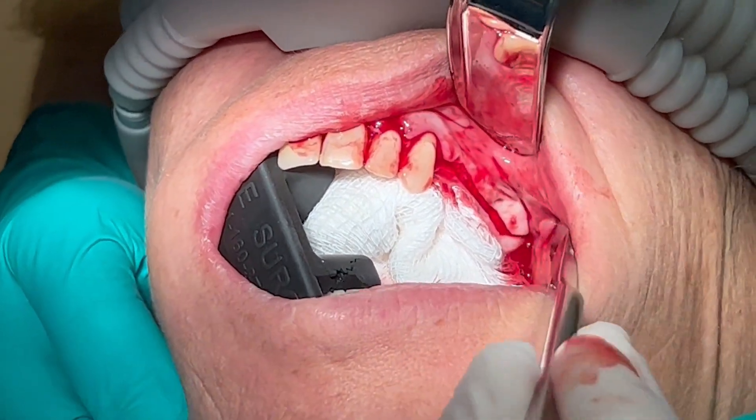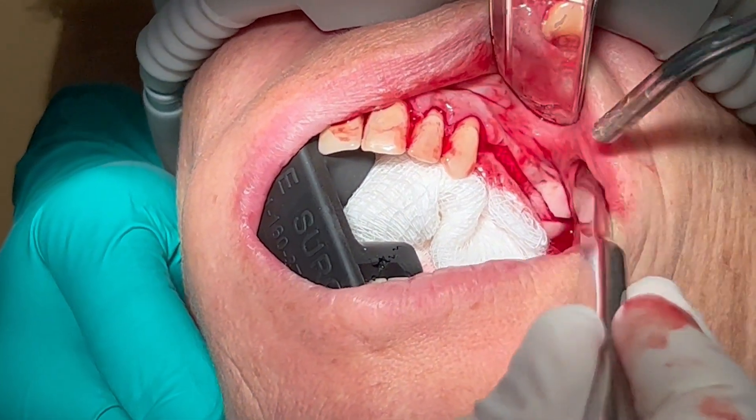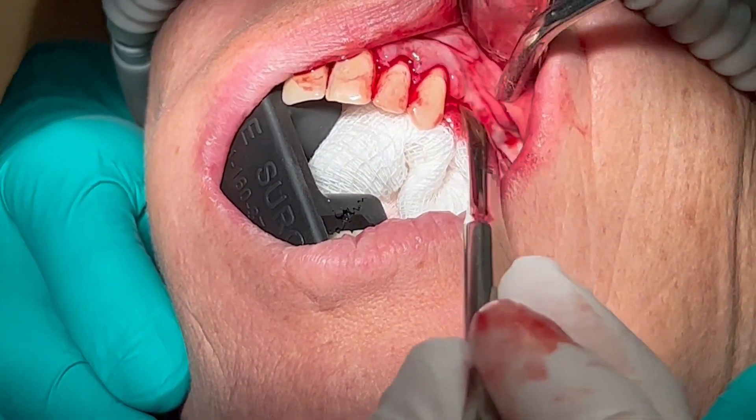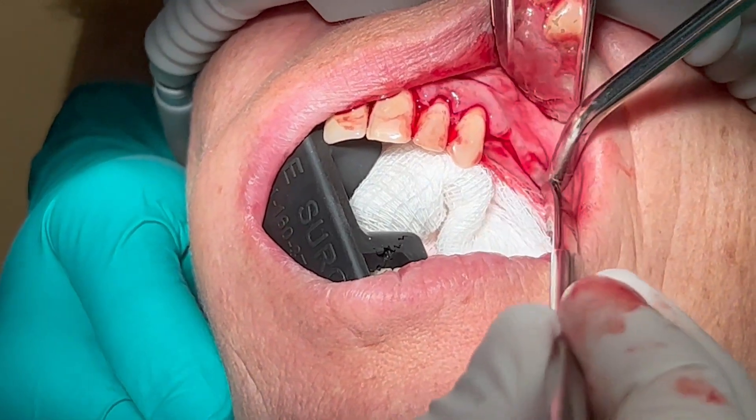Now I'm going to irrigate the site very thoroughly. I'm going to lay my flap back down and obtain a primary closure using micro sutures. I placed this patient on antibiotics and decongestants and saw her back two weeks later. The site is healing great and the pain and pressure she was feeling in her mid face have gone away completely.